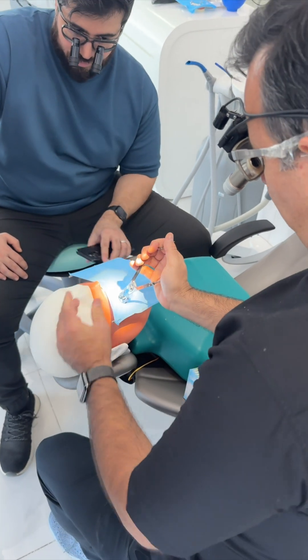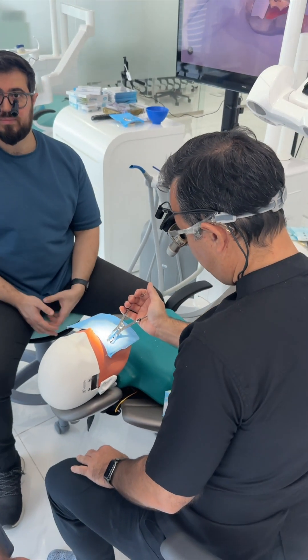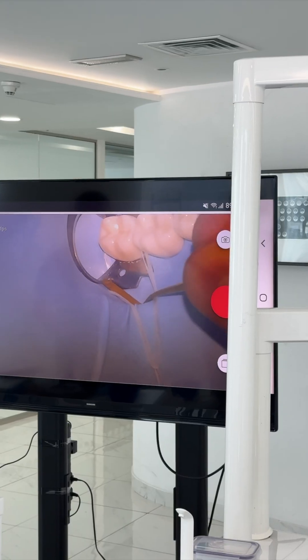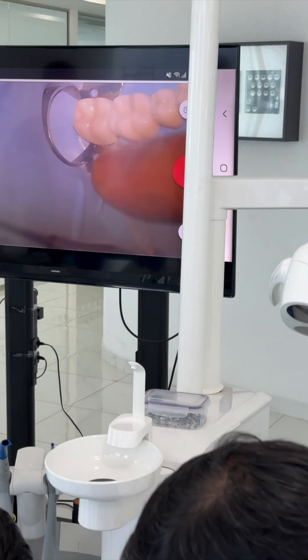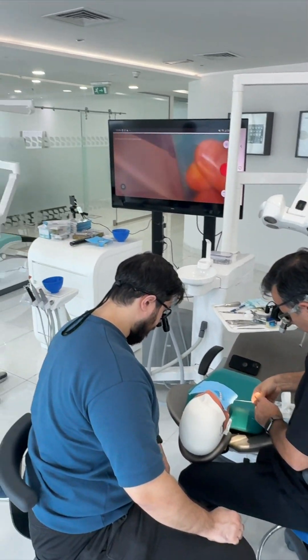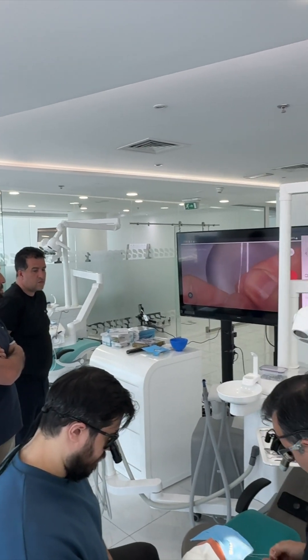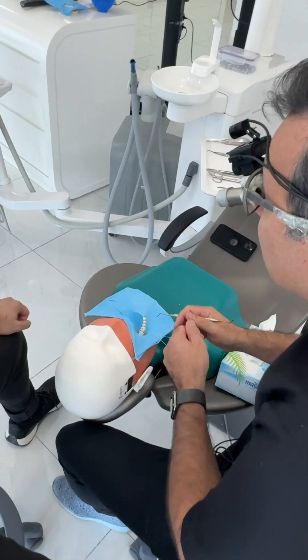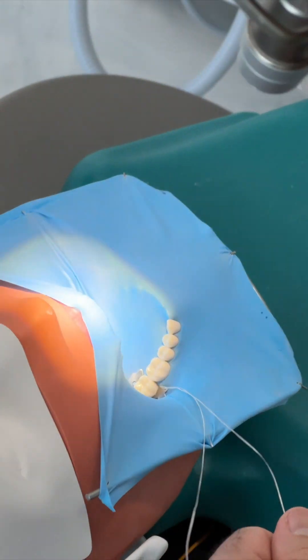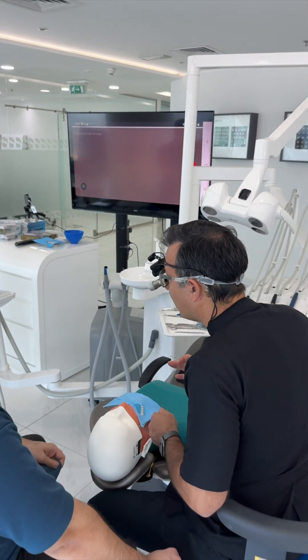Put my hand down and now perfect visibility on the clamp. It's important to use loops because now I can see what's happening with the spatula or anything. Keep it at a 45 degree angle. Where do I place this? Not always — only when I have a Class 2 I place the clamp, and I have a better loop. Is there any saliva coming from there?